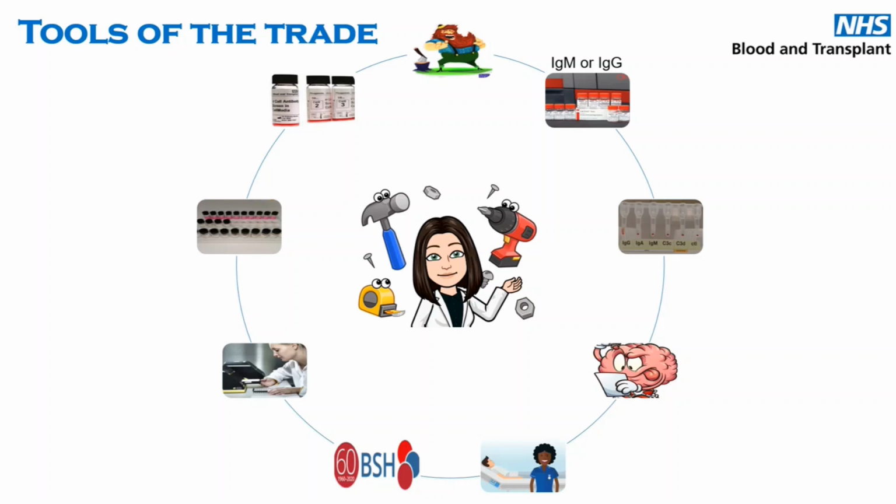Could be an autoantibody, could be to do with any illness that they've got. They could just be positive, might just be one of those few patients that's that positive, or it could be because they've had a transfusion. But that can actually interfere with the IgG anti-sera, so that's also something that's worth bearing in mind when you are phenotyping a patient.